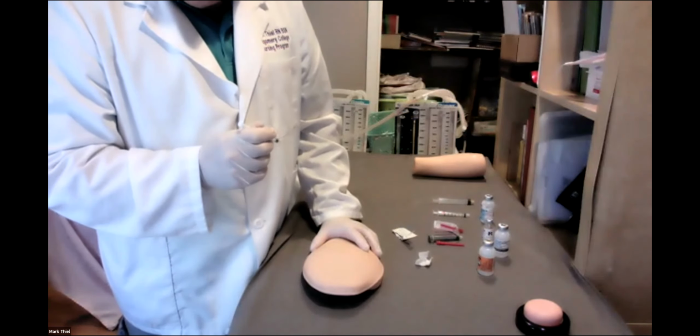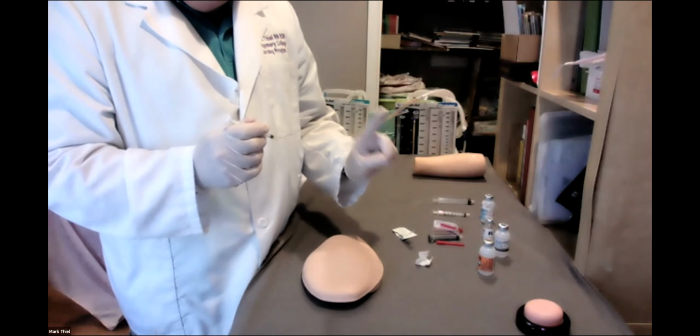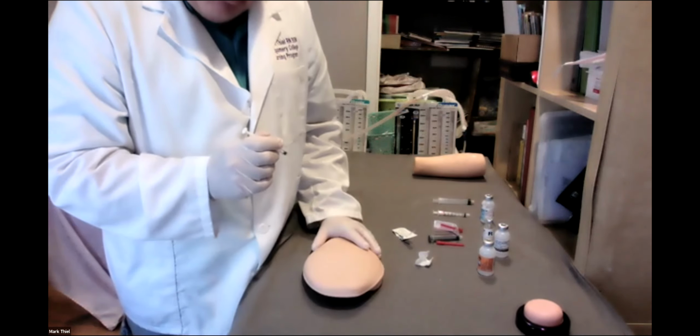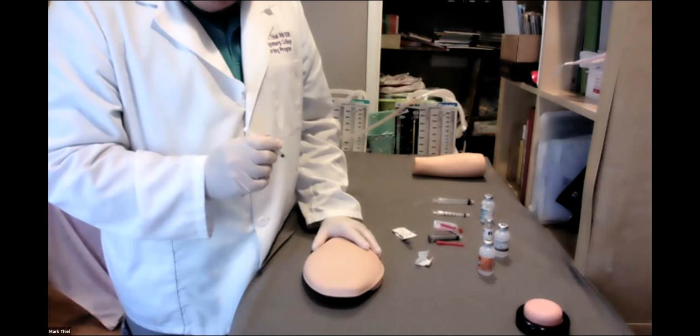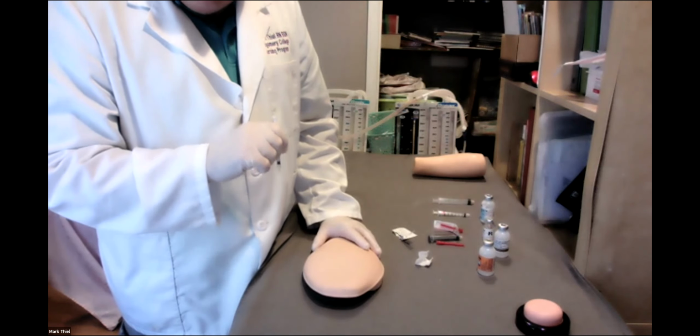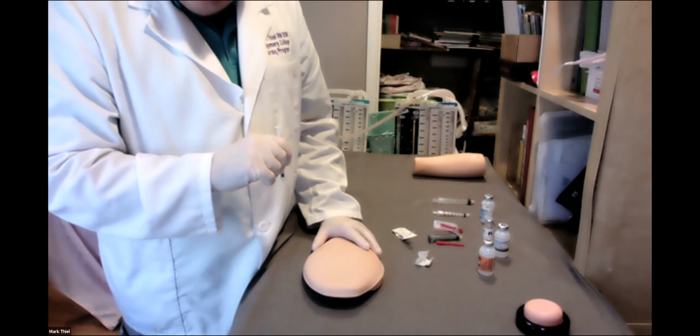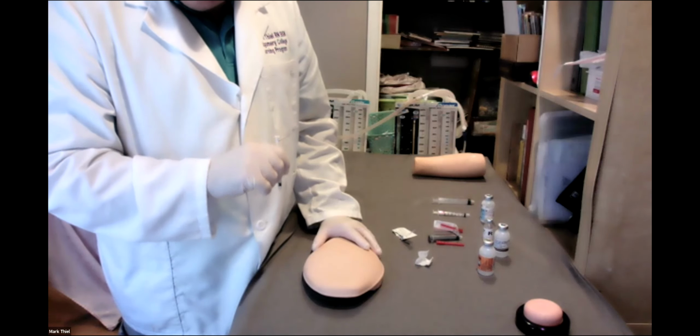Then angles of subcutaneous injection. The range of the angle is 45 to 90. Now, most patients that you will see, and the nurse can do with the pre-prepped needle, which is less than 5/8 of an inch, you can go 90.